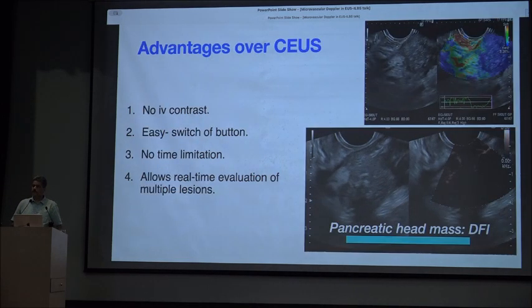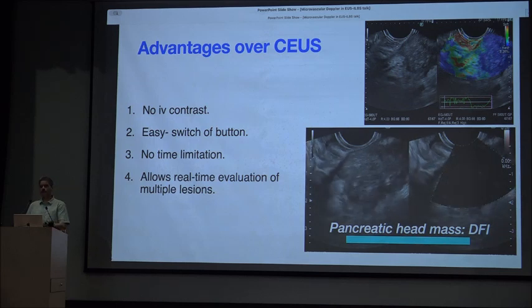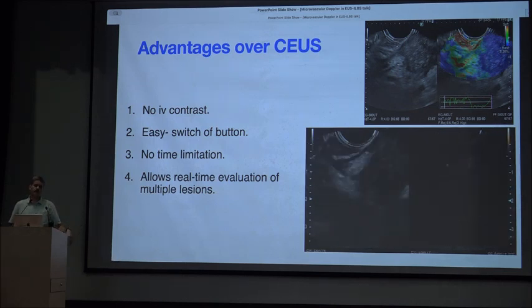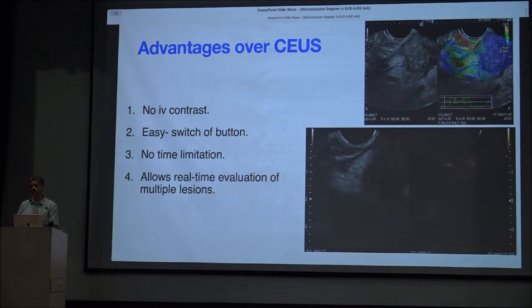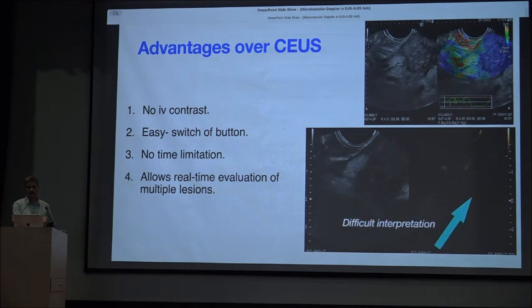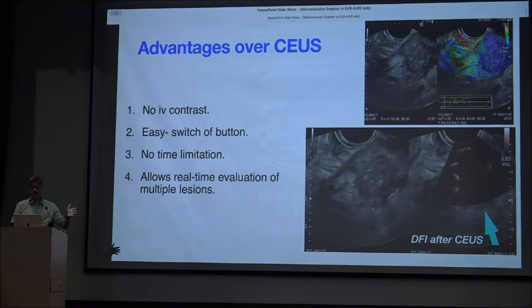There are certain advantages also over IV contrast. Number 1, no IV contrast is required. 2, it is very easy. You just have to switch a button and the DFI is on. There is no time limitation. A contrast washes out completely, we use SonoView, within 3 minutes, but here you can play on for as long as you like. With contrast you are restricted, but here you can actually move over an organ with DFI, so you are not restricted to one plane or time.